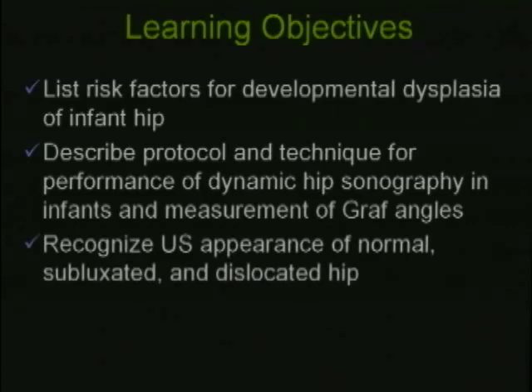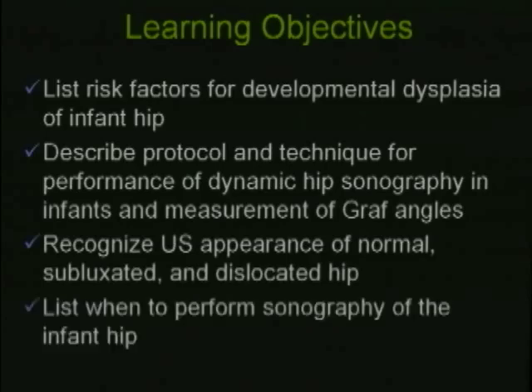You should be able to recognize the ultrasound appearance of the normal hip, the subluxated hip, and the dislocated hip, and be able to list when to perform sonography of the infant hip.